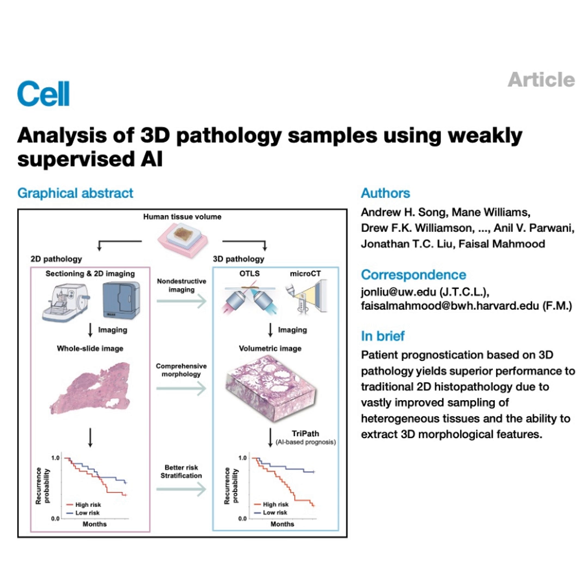It implies that the human brain, even a highly trained one, finds it incredibly difficult, maybe just non-trivial, to mentally reconstruct and interpret that full 3D complexity from hundreds of stacked 2D images. The AI seems to handle that volumetric information more effectively. That's a huge point. It's not just about seeing more, it's about processing it in true 3D. Exactly.